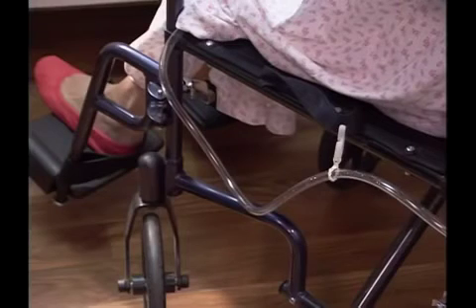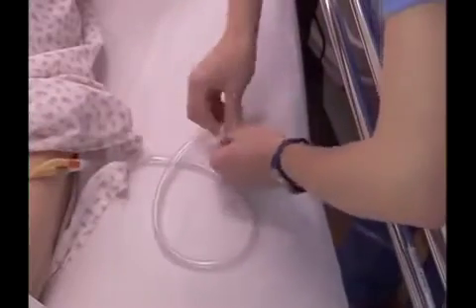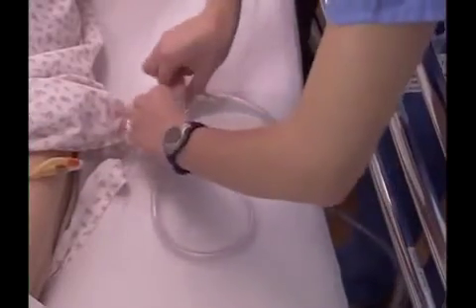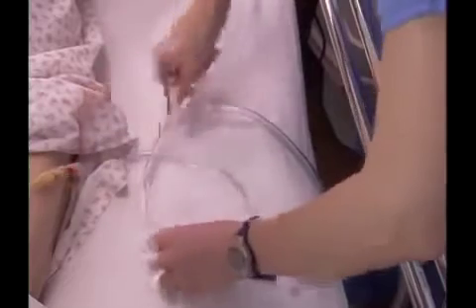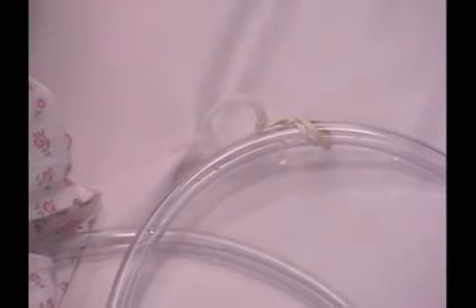As you can see here, a little bit of slack is left in the tubing to prevent the catheter from pulling against the bladder outlet and the urethral opening. When the person is in bed, make sure a little bit of slack is left in the tubing. Then gently coil the remaining length of tubing and secure it to the bed linens using a plastic clip or safety pin. Coiling the tubing prevents the tubing from becoming bent or kinked, which would stop the free flow of urine into the drainage bag.